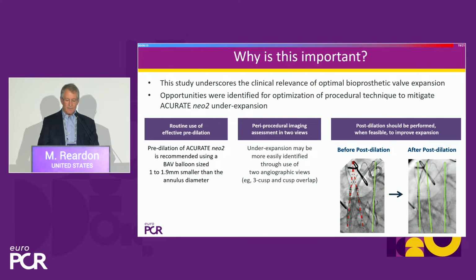And this study really underscores the clinical relevance of optimal valve expansion. I think we all now start to agree that that applies to every single valve in the TAVR field. Underexpansion is a problem. There are opportunities that we identified for optimization of the procedural technique to mitigate against underexpansion. And the routine use of effective pre-dilatation is very important.